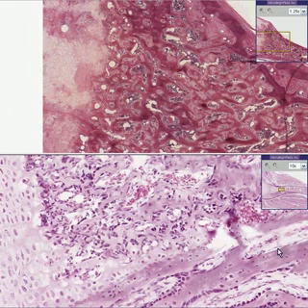Here's normal bone, here's calcification, here is the proliferating zone of cartilage eventually being replaced by osteoblasts. And this substance here in between osteoblasts is matrix, or osteoid, which when it becomes calcified, like it is here, eventually becomes bone. This is the normal process of endochondral ossification. It is dependent on many things, generally good health, good blood supply, and a lot of specific chemicals, among which one of the most important things is vitamin D.